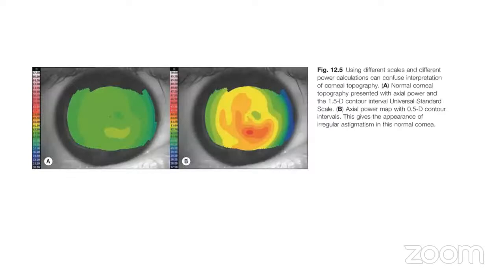This is another image. The first image shows normal corneal topography presented with axial power and the 1.5 diopter contour interval universal standard using a universal standard scale. The second image shows axial power map with 0.5 diopter contour intervals. This gives the appearance of irregular astigmatism in the normal cornea.